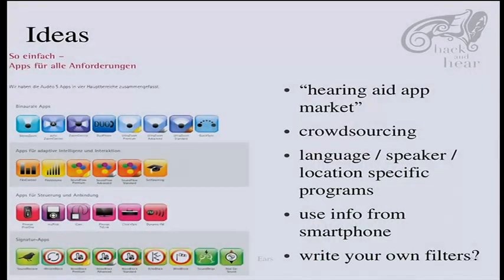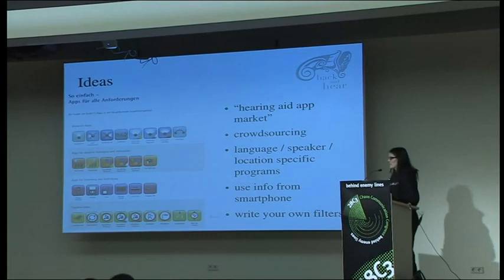But I don't see most of it coming in the next 500 years because the companies are not very open source friendly. So what would be really cool to have is something like a hearing aid app market where you can download the newest feature for background noise removal or something, and where you can write your own filters and share those, and especially exchange those between different brands.